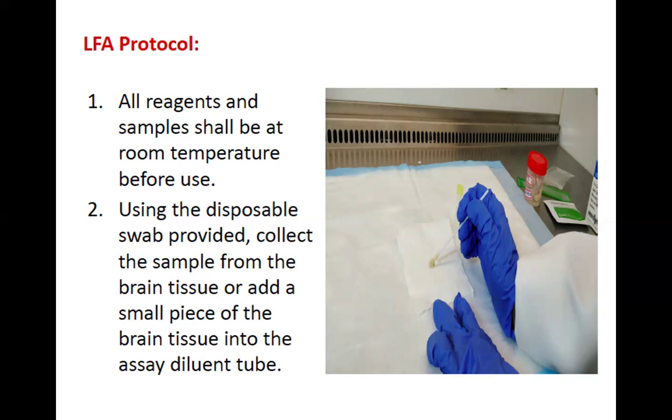Antigen means the one that you want to measure: the virus, the bacteria, the protein. So you have to think about the protocols that enable you to have the optimum amount being collected. Sometimes if you just use what we call a dropper, for example we are working with sputum.